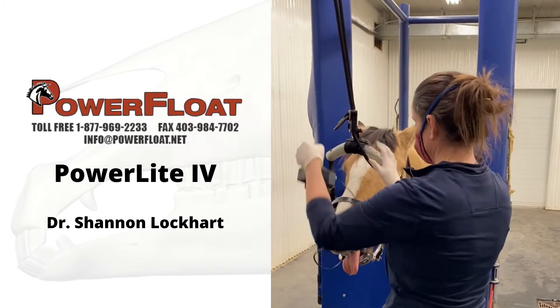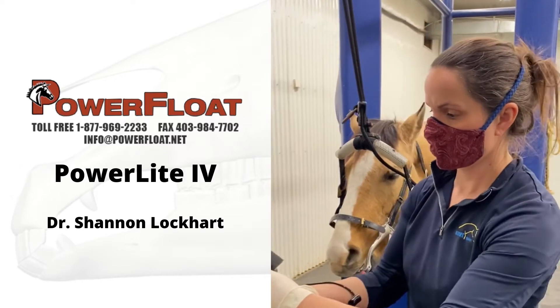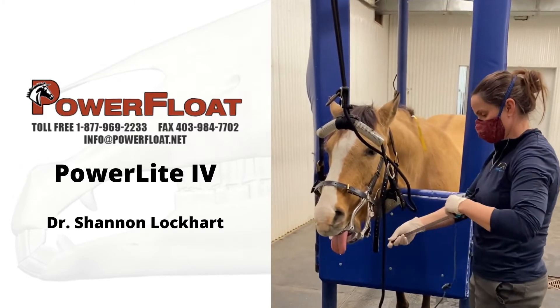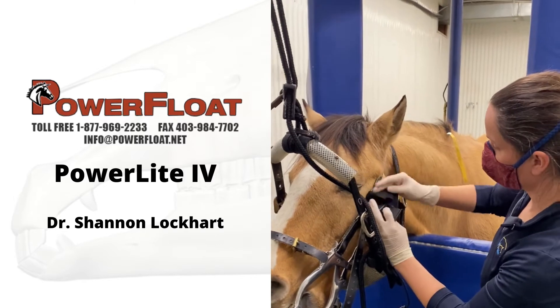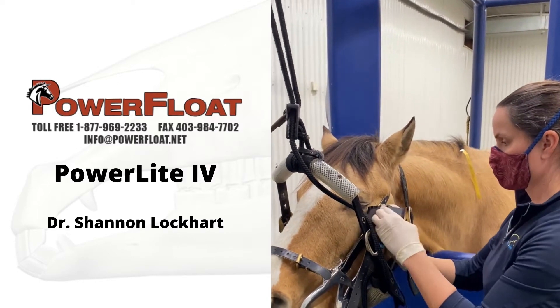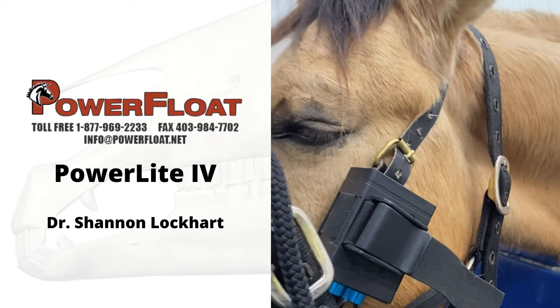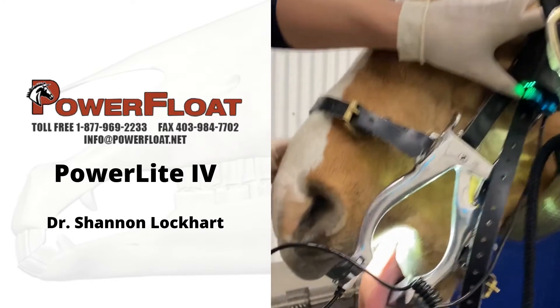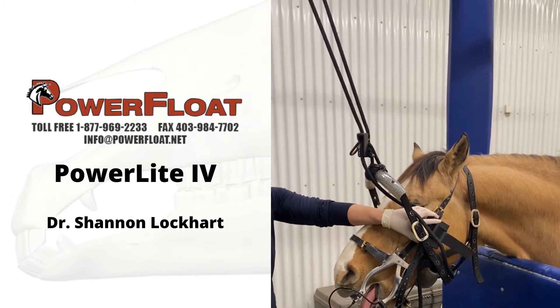If you don't have a dental halter, the other way you can attach it to the horse is right on the speculum. All you do is take your carabiner off and it attaches right to the speculum. The easiest way is to slide it on before you put your speculum on so you don't have to undo everything. Or you can just do it this way — tighten, push, and then it's on the horse just like that.